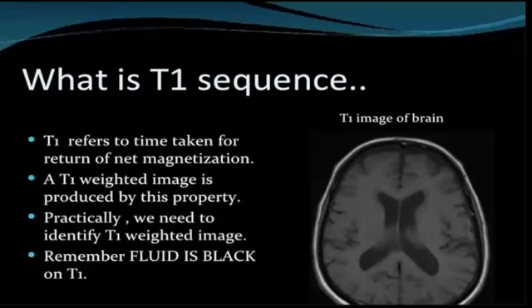Now, why did I go into all this boring physics that I went through at the start? It's just to make sense of this. Whenever you're getting a T1 sequence, it means that you send the radio frequency wave for a short time. It means that you have a short excitation time, and it takes the hydrogen protons a short time to relax, this is what we mean by the relaxation time, okay?